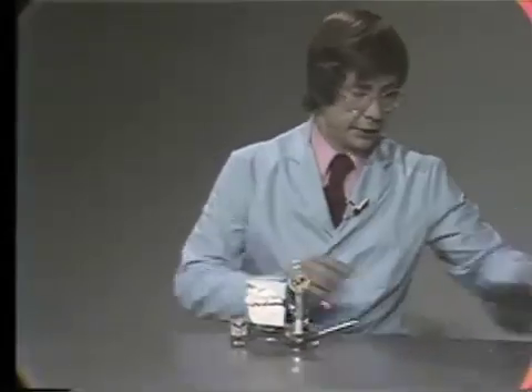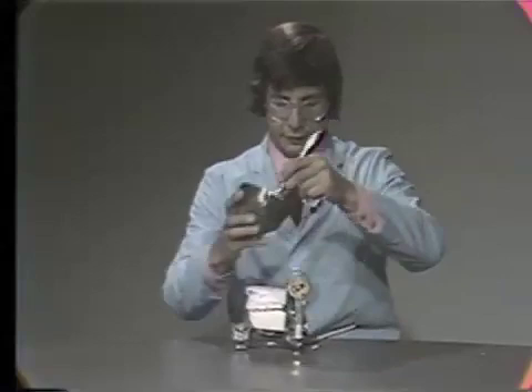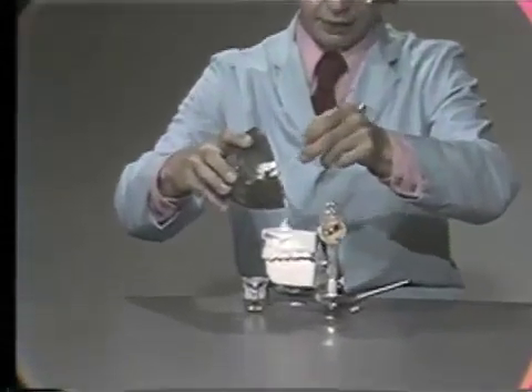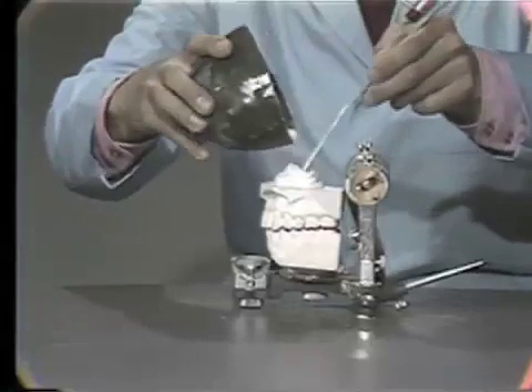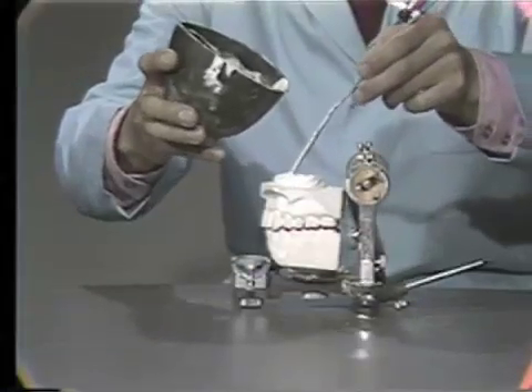All we've got to do is put plaster between the articulator ring and the upper model. Open it up, take some plaster — you should have soaked the top half in a little bit of water so that you get a better bond.